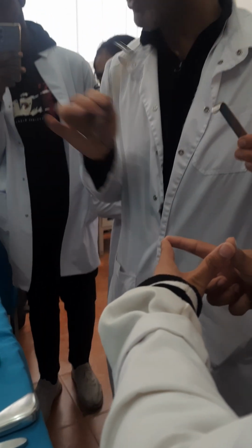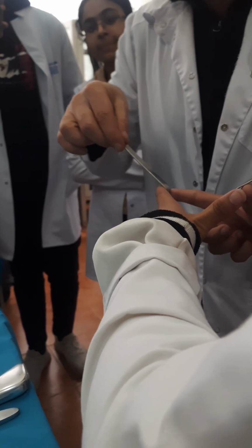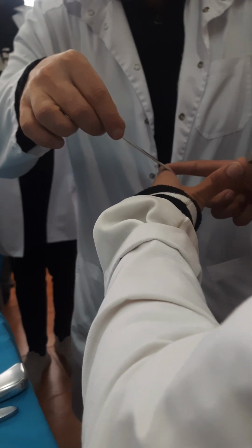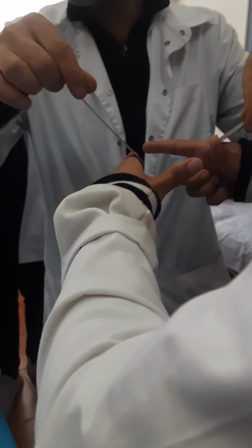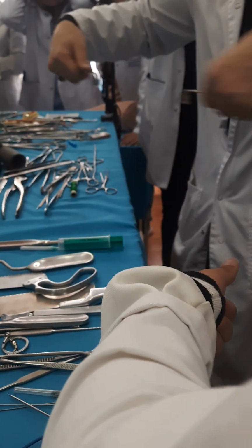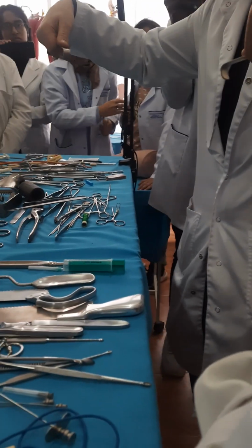Now, I must enlarge this incision. How do I do it? There are different ways, but the most simple: I apply it into the angles. Then I don't enlarge anything yet. I lift a little bit, and from the angles I come to the margins. And now I'm not only enlarging, but of course I am lifting the structures upwards. How do we hold it? It is in your fingers, first fingers oppositely, and in this direction you make the traction. You lift and you tract, and you enlarge.